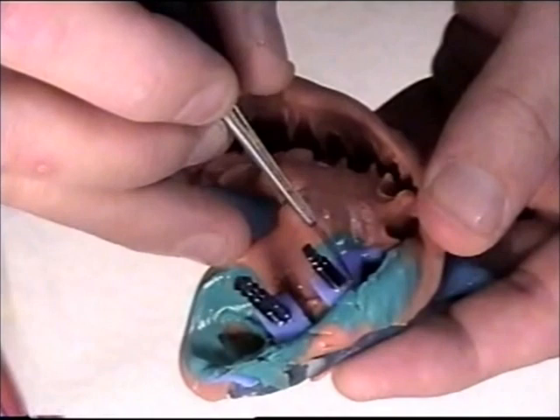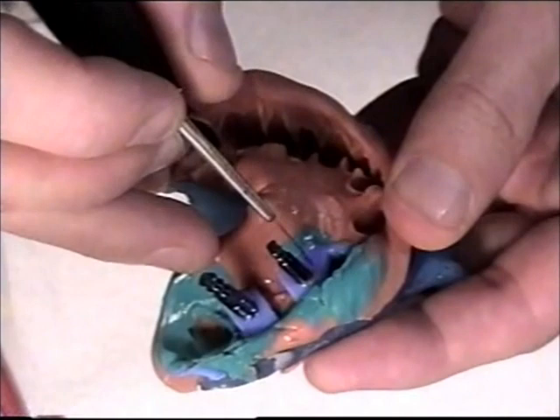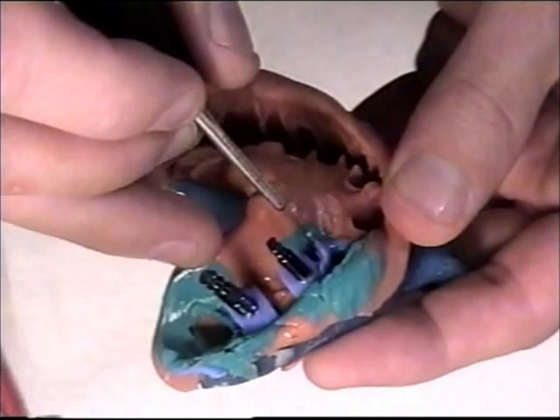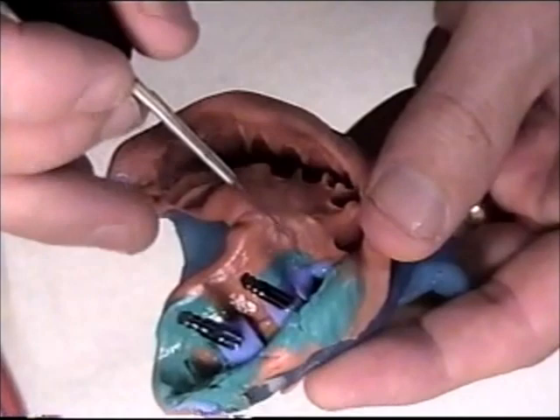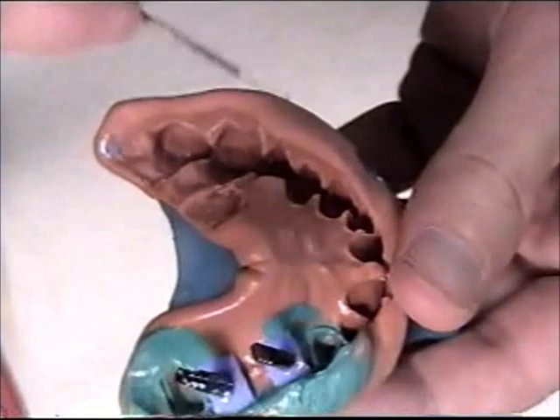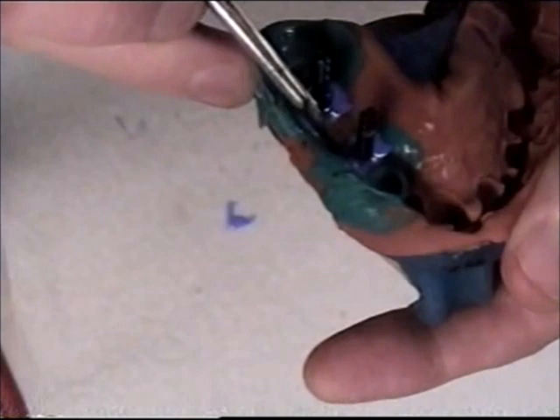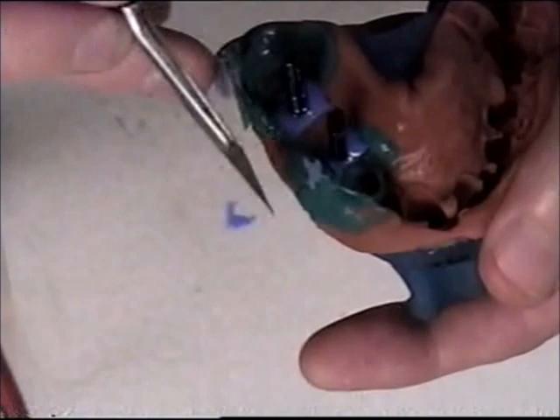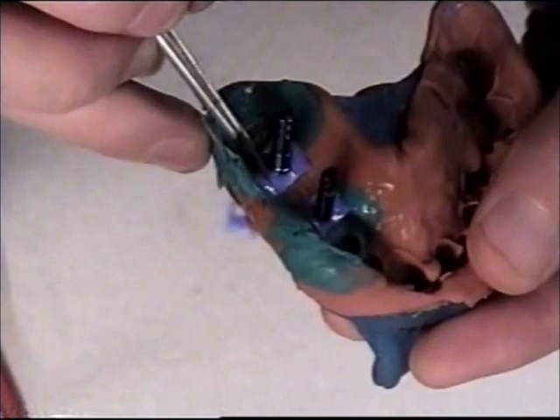I'll make another cut on the mesial. I don't want to cut into my prepped area there on my adjacent tooth, so I have to be careful there. Then I'll cut on the buccal, and on the lingual.